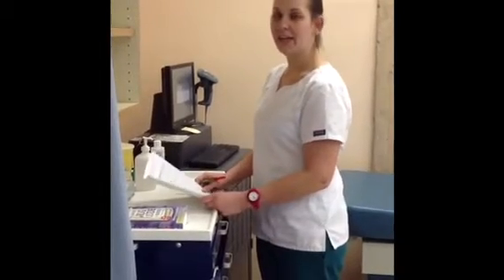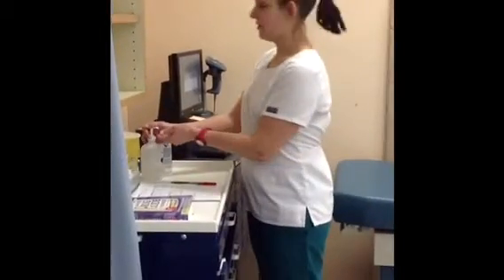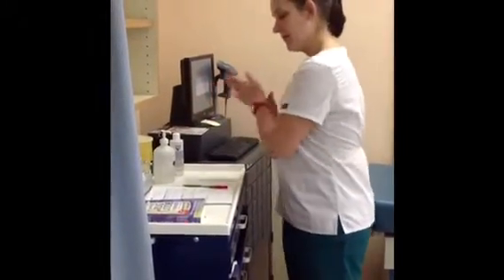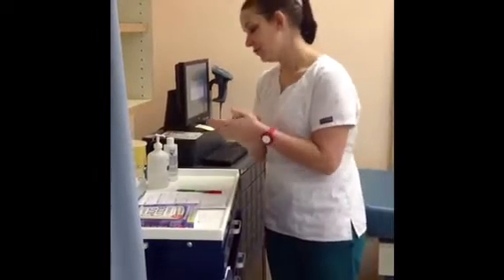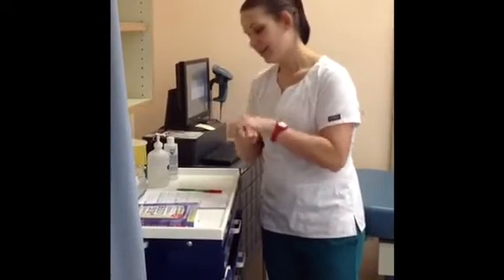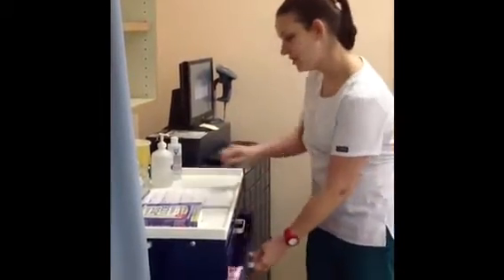I am preparing an IM injection for a baby. So I'm going to start this by washing my hands. I have an MAR with an order from the doctor here, so I'm going to gather my supplies and get the medication out. I would unlock the medication cart, and I have my information here.